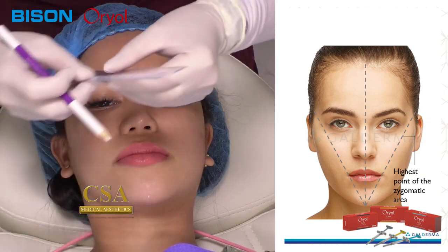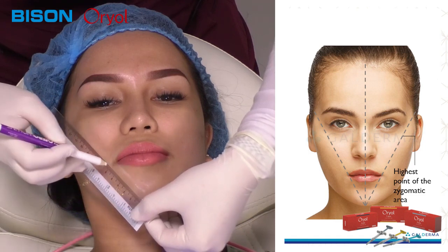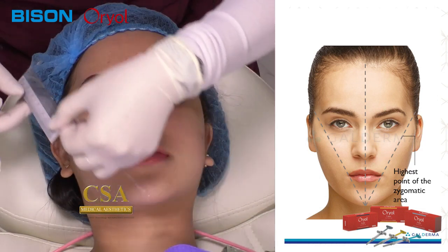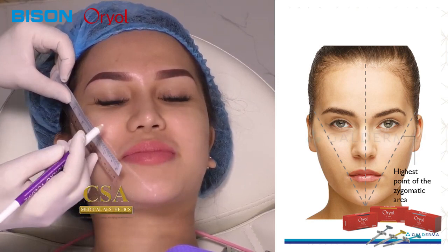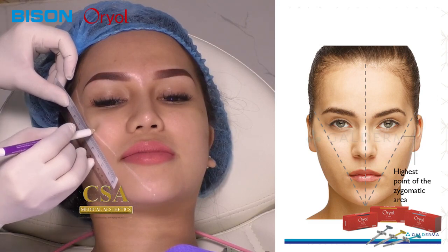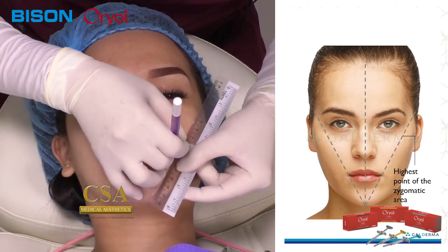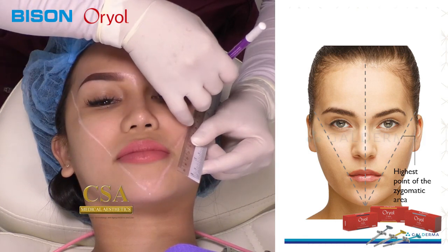From this part, the inferior aspect, we'll make a diagonal line, from this to the corner of the mouth, and from the corner of the mouth going upwards, because Kim Liana is more of a Caucasian. Do you agree? Disagree? You're more of the Caucasian side, right? Because we Asians have this round-shaped face, a wider and shorter face, but Kim has a longer and narrower face, which is good, right?